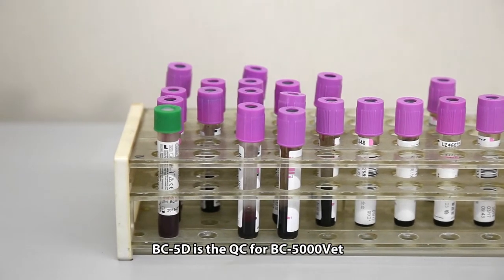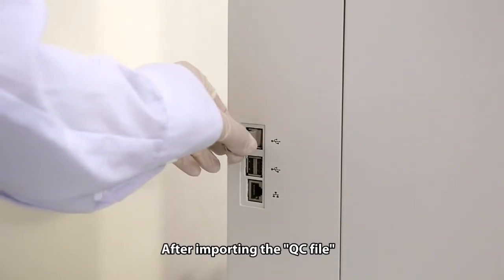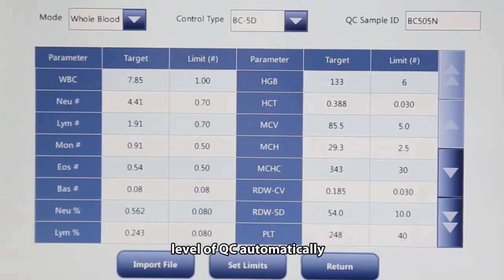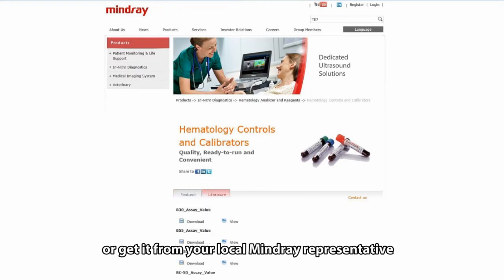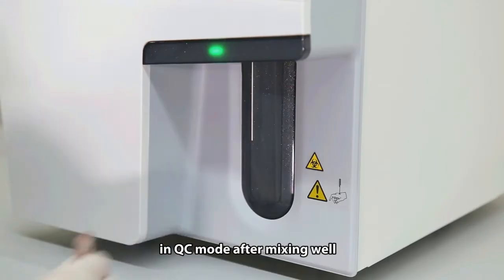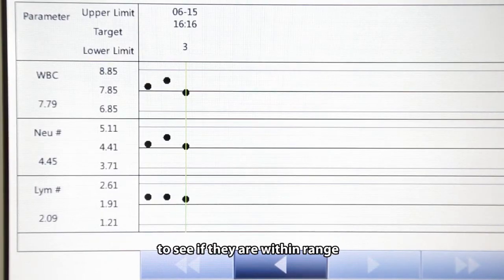BC 5D is the QC material for BC 5000 VET. Its shelf life is 3 months, but you have to use it within 14 days after it's opened. After importing the QC file, BC 5000 VET can load the target value, lot number, expiration date, and level of QC automatically. You can download the QC file from MindRay's website or get it from your local MindRay representative. You may also input the QC target value manually. Run the QC through the sample probe in QC mode after mixing well, and review the QC results in the LJ QC graph to see if they are within range.